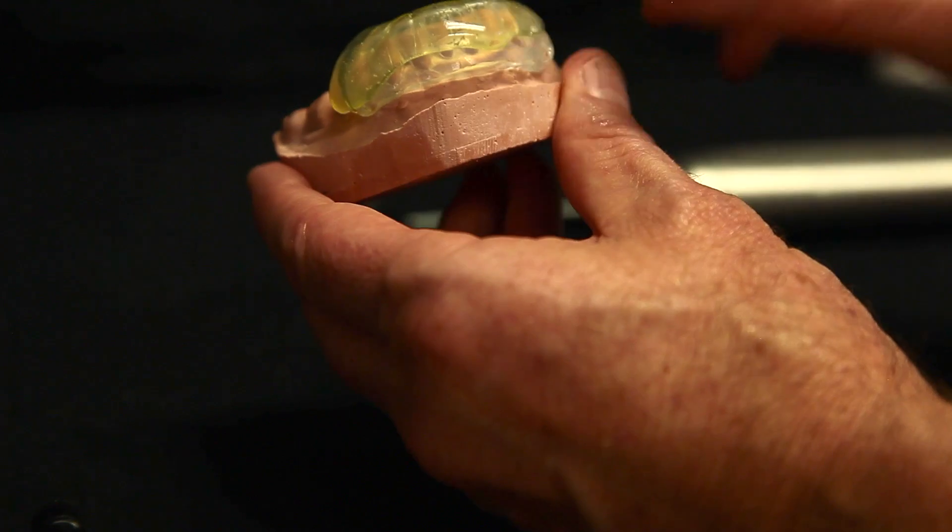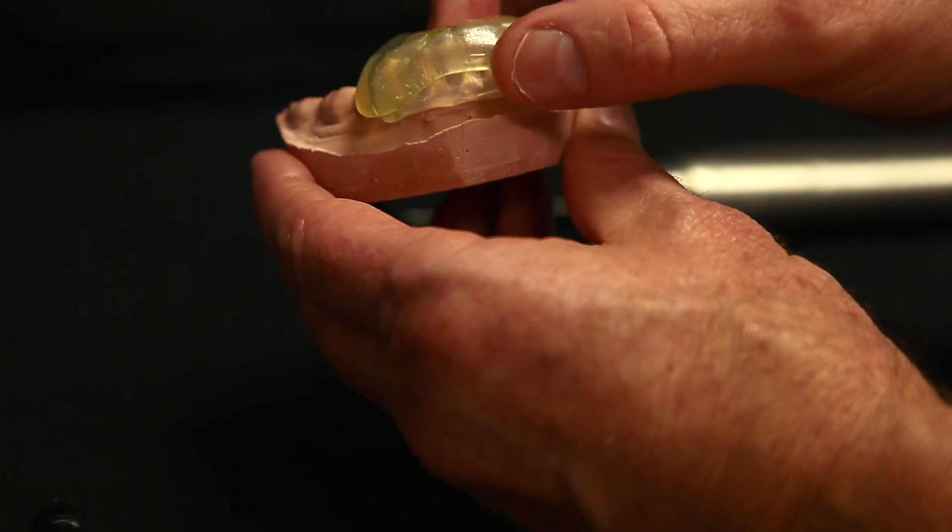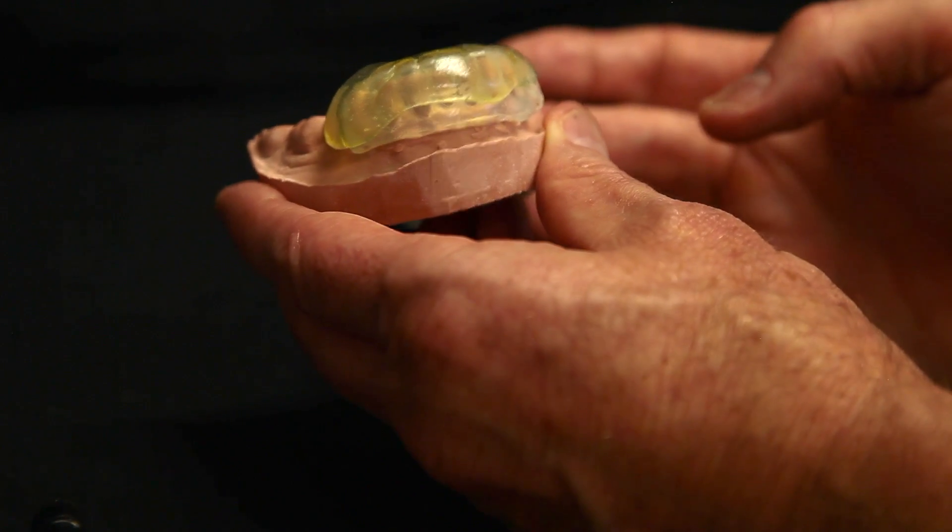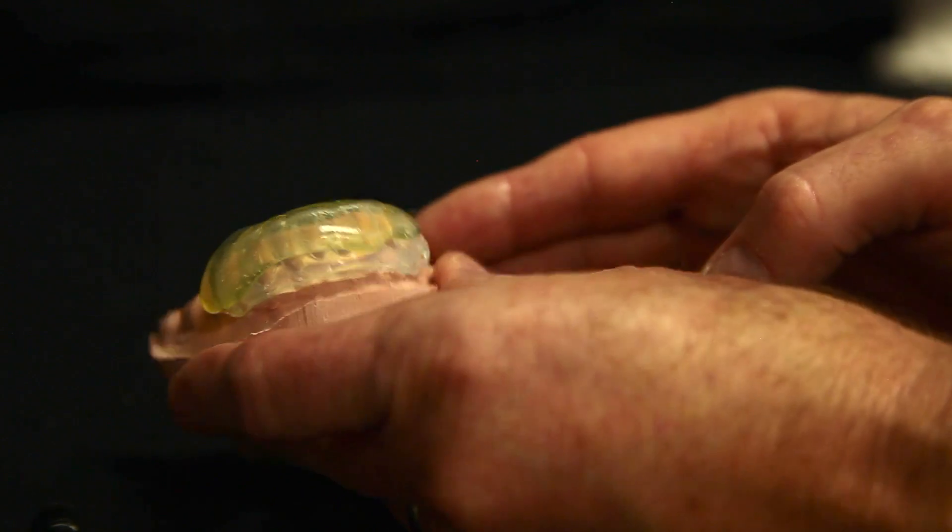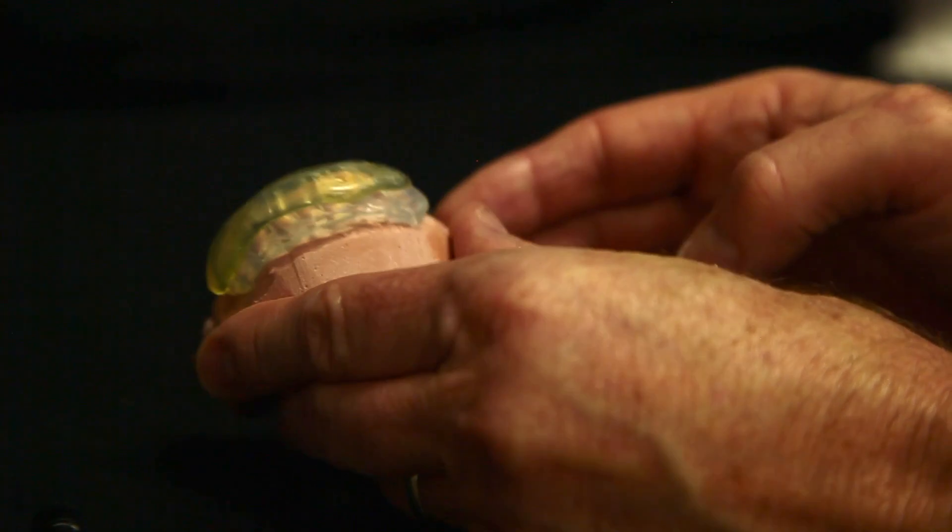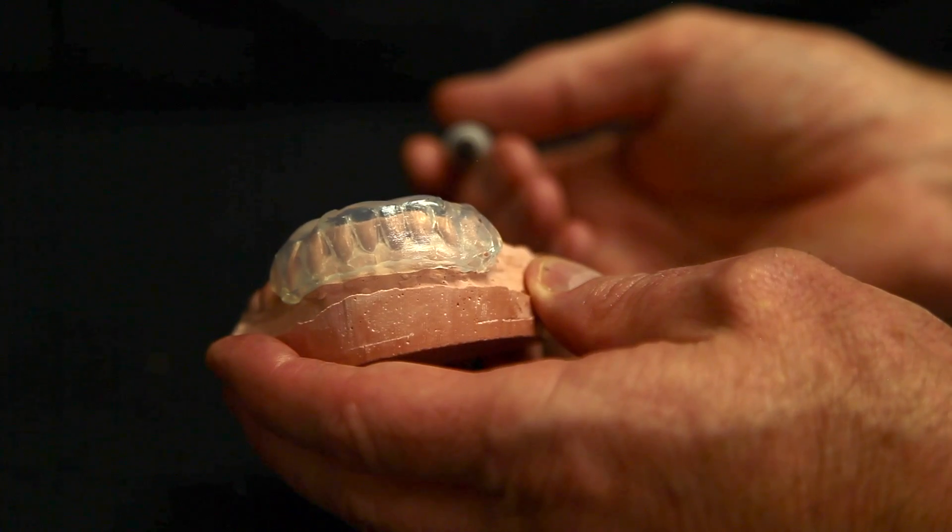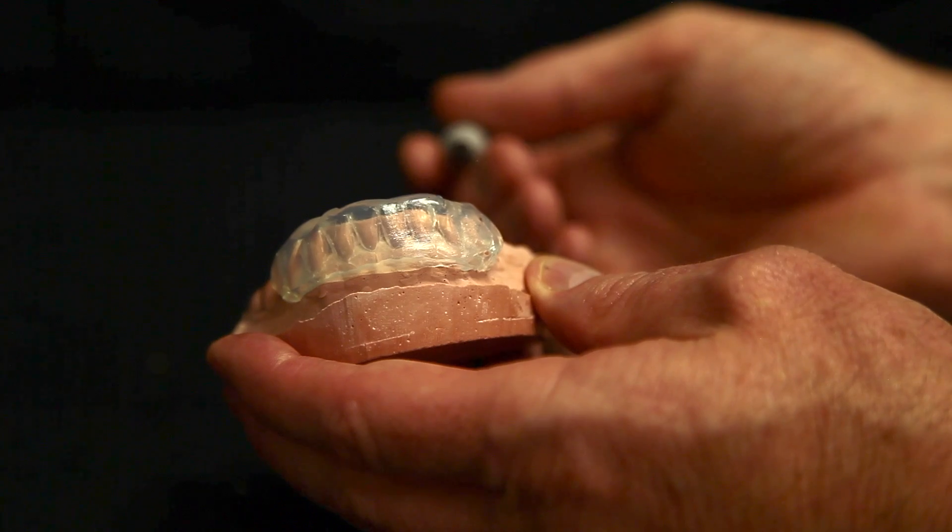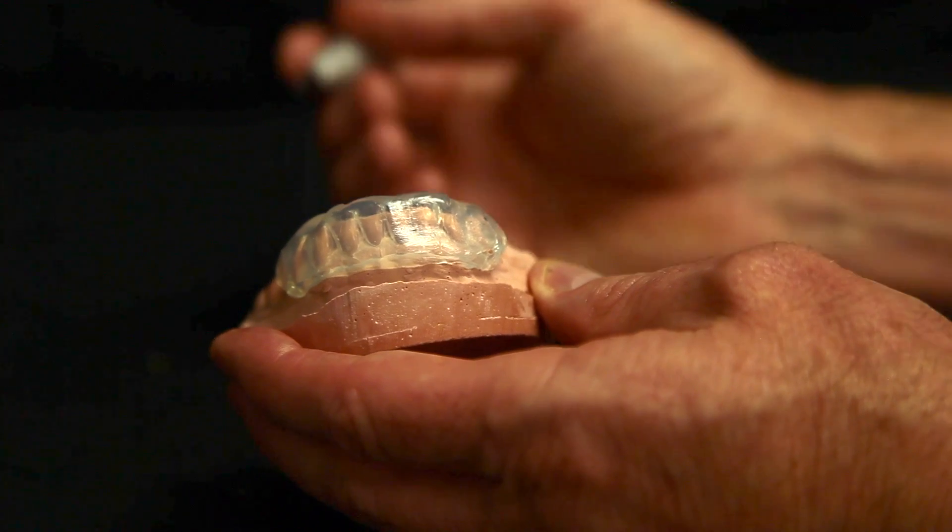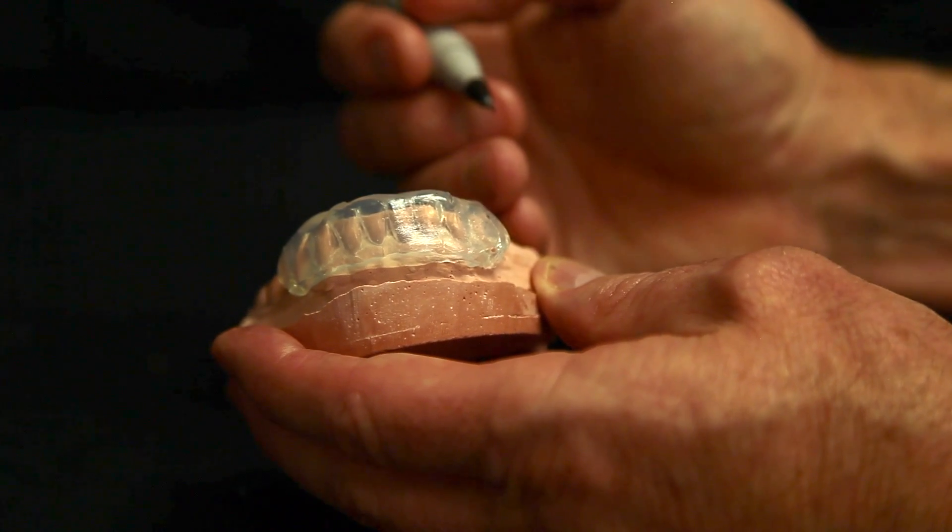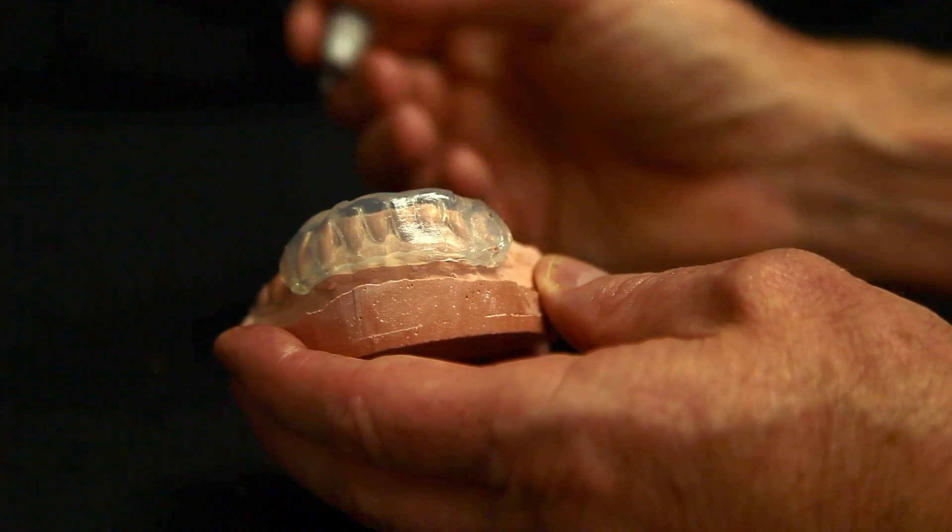After you've done this, you can go ahead and pull this off your wax-up and then put the shell in your Triad unit to finish the curing. But don't put your wax-up in your Triad unit. So the final thing that you'll need to do to prep your matrix to take it to the patient's mouth is decide where you're going to place your vent holes or your access holes.